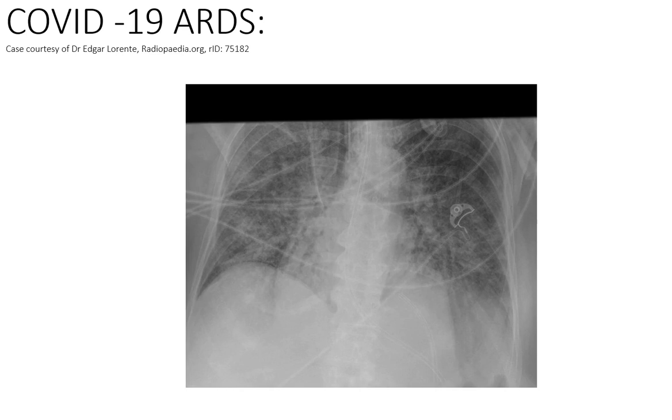But an ARDS type picture, just a pure ARDS picture of inflammation, or an interstitial picture where, say, pulmonary edema, that's not something that physiotherapy can usually have a positive effect on. So these patients are presenting slightly differently, is my understanding.